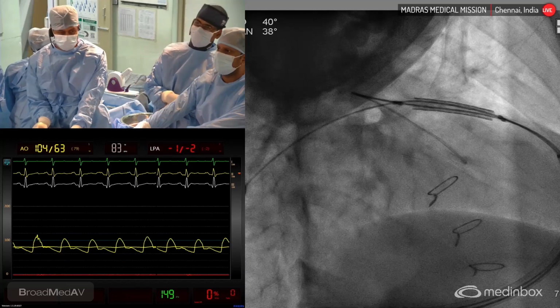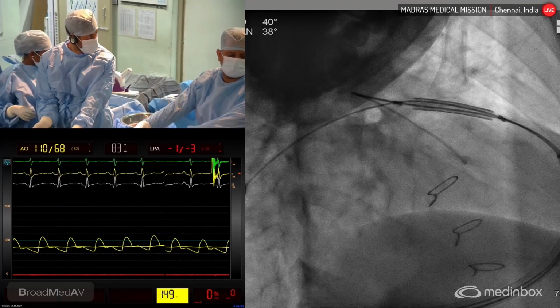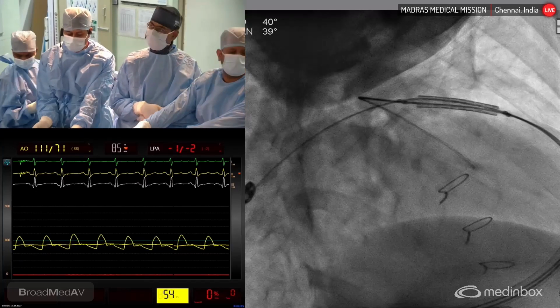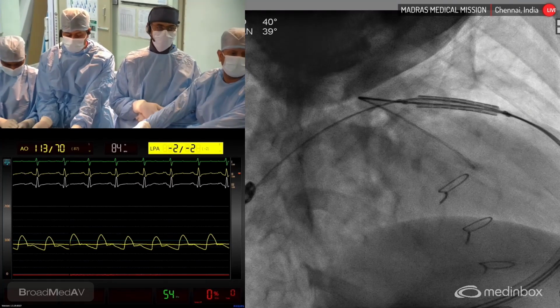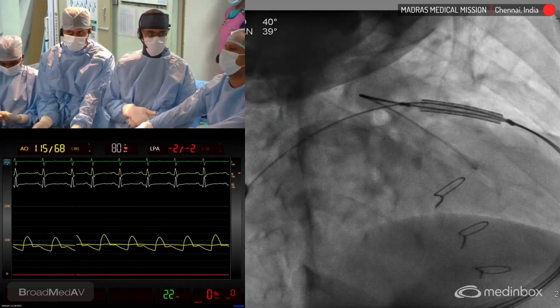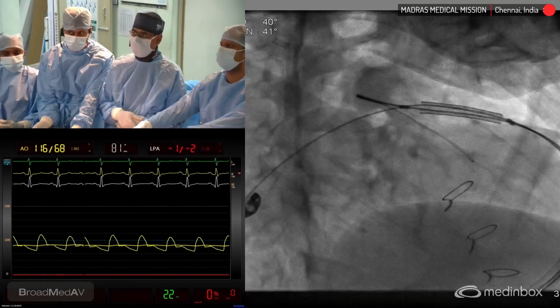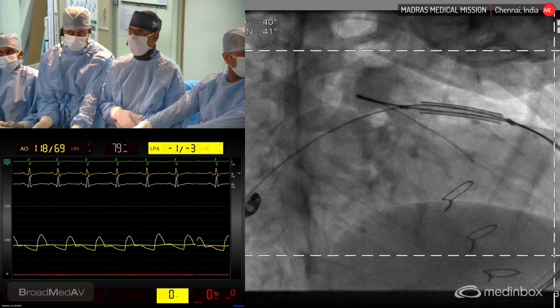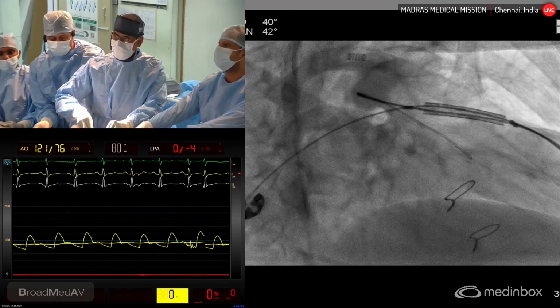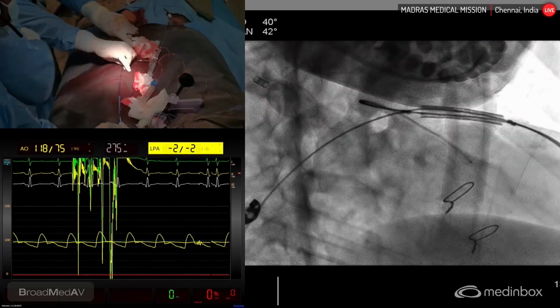So the patient's face is getting exposed, and so tell the anesthetist the face can be turned, maybe the chin up. Okay, more cranial, and collimate the chin part. Okay, that's fine. Yeah. So here let us make an angiogram and see how far we are from the bifurcation.